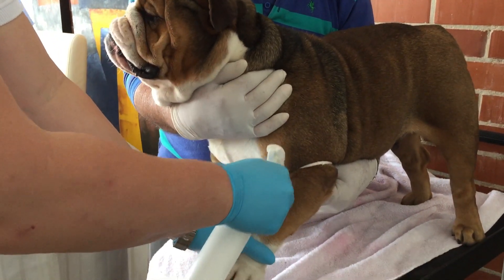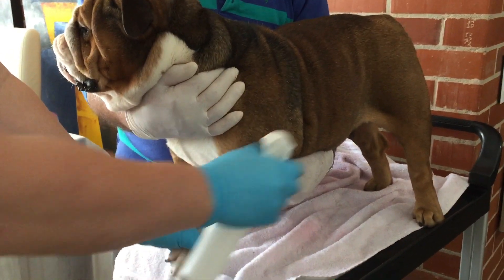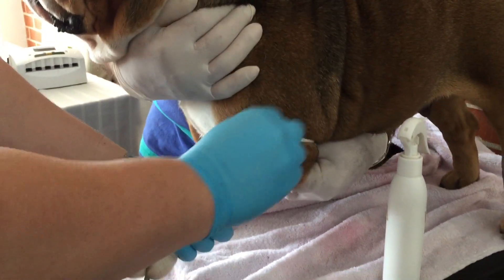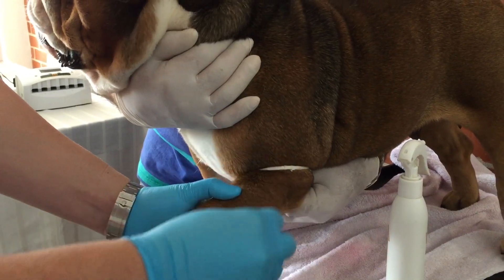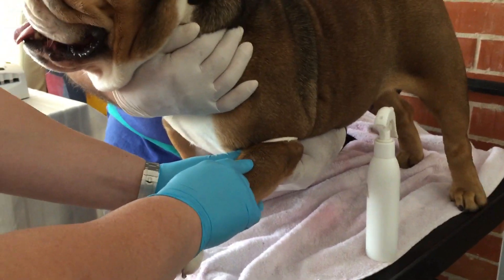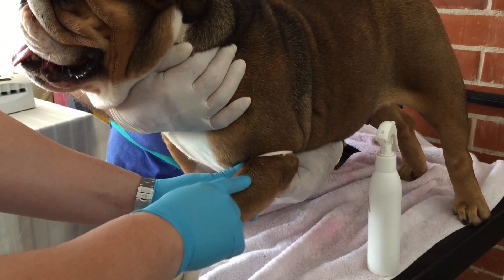I'm going to collect the blood for the progesterone. This is just practice — it's not as hard as it seems, but it does take practice because some dogs you can't really see the vein in them. You want to constrict and twist the leg a little bit so you can feel the vein so it comes out.